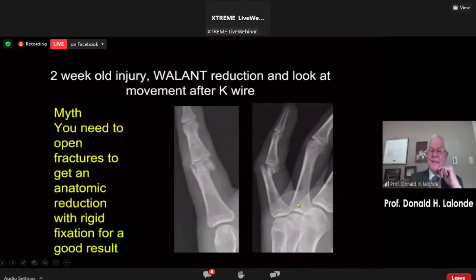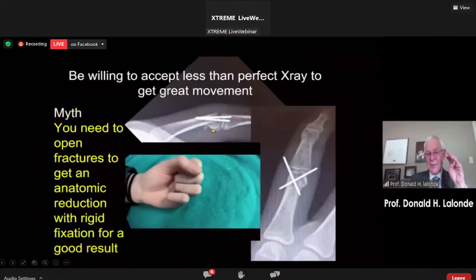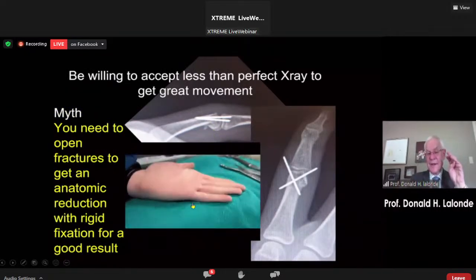So here's an example of you don't treat an X-ray, you treat a patient. So in this case, you think, oh, I gotta open this because this is awful. This is a 2-week-old injury in a young person. And I just did it with WALANT. I pushed and pushed and pushed until I reduced this. Then I K-wired it. And my X-ray is not perfect. See that? But on the table, the movement was perfect.